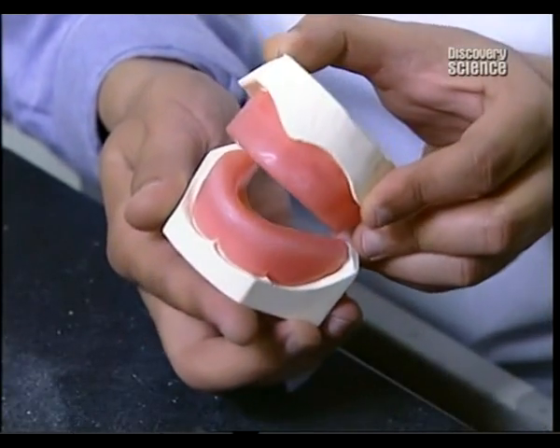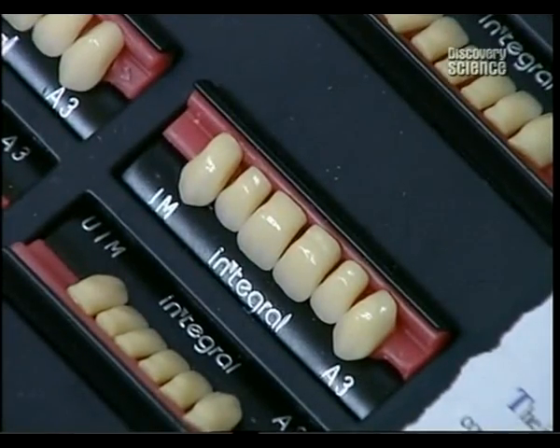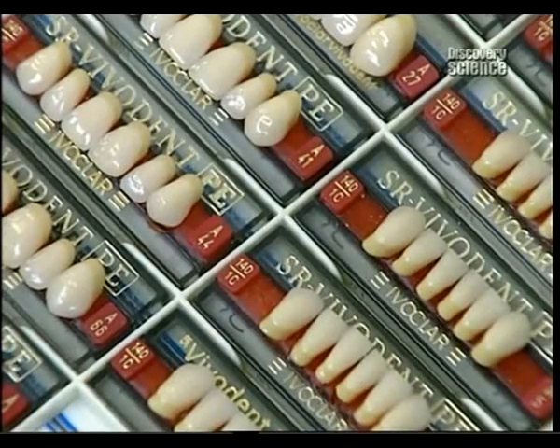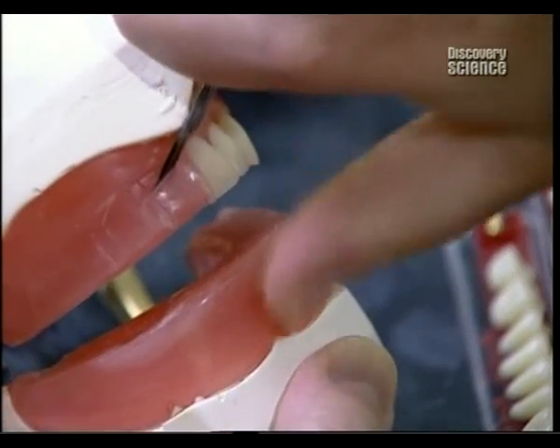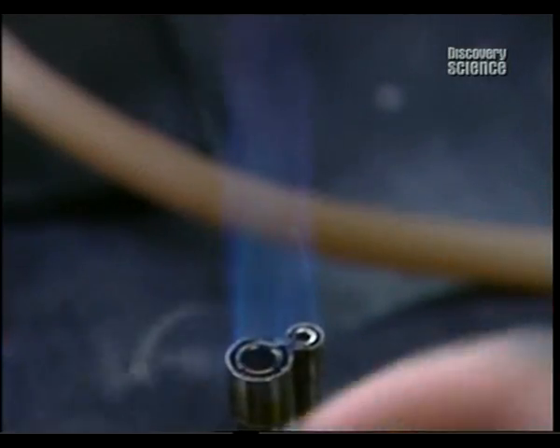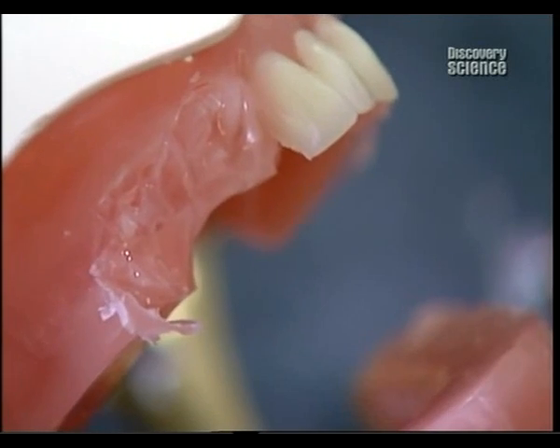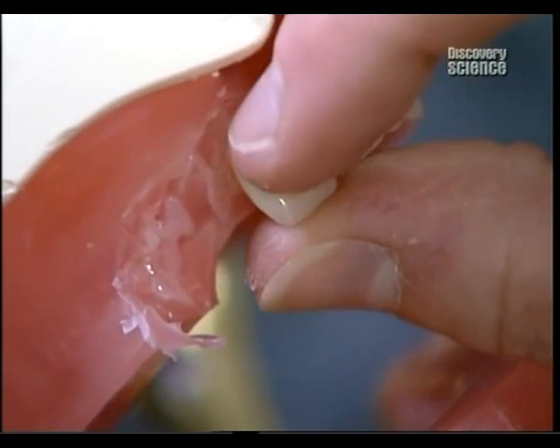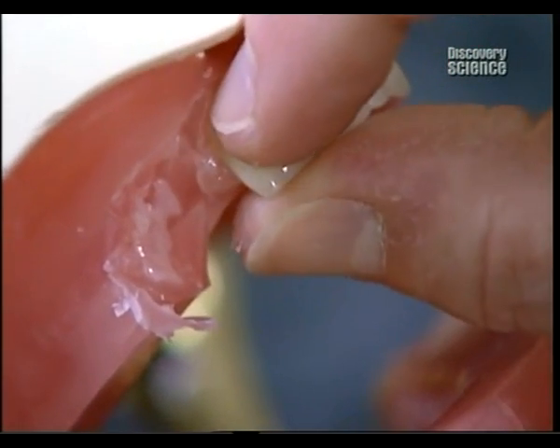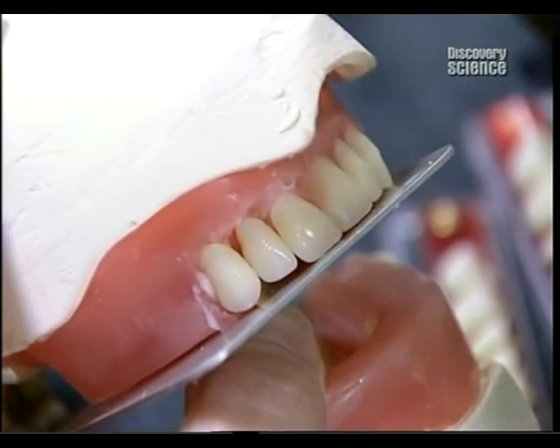The dentist takes a series of measurements to show the lab exactly where to place the teeth. The technicians then select the teeth that will best suit the size of the patient's mouth. The teeth are installed one by one into the model's wax rim, which is then sent back to the dentist for final fitting. The dentist checks that everything is centered and that the patient's bite is properly aligned.